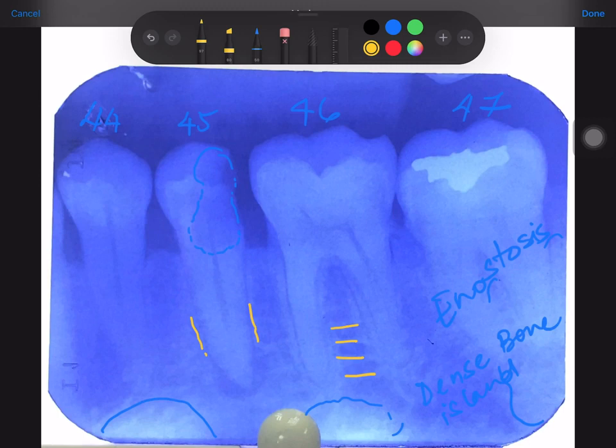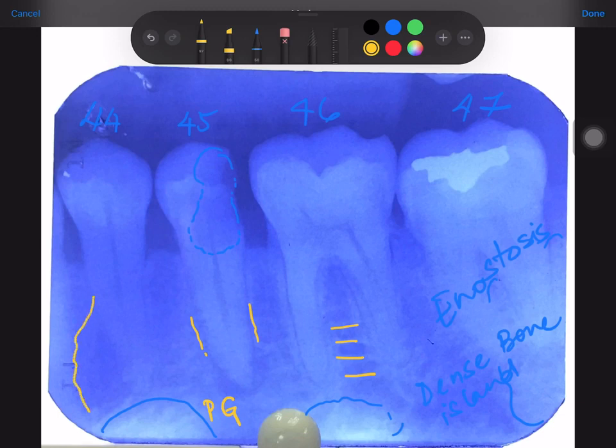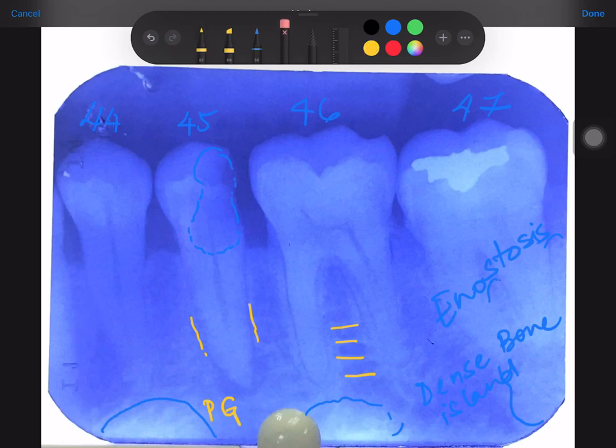So what should this radiolucency be? A periapical granuloma — good answer. Are there any other radiolucencies we can see? This area looks a little confusing, maybe a little smaller.